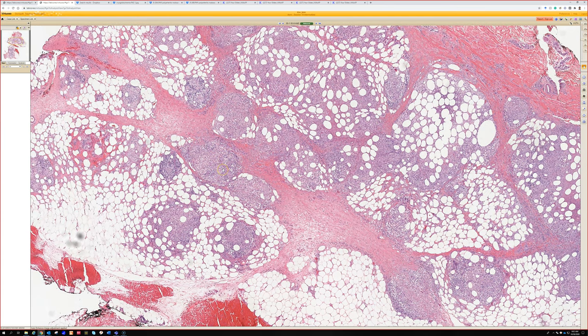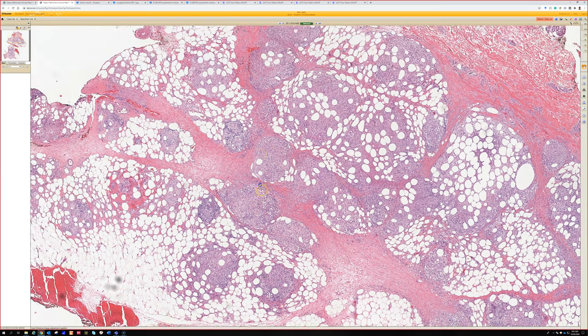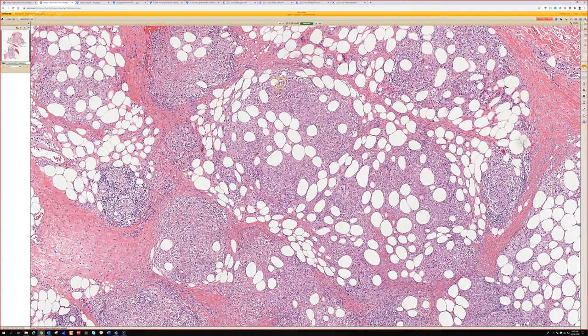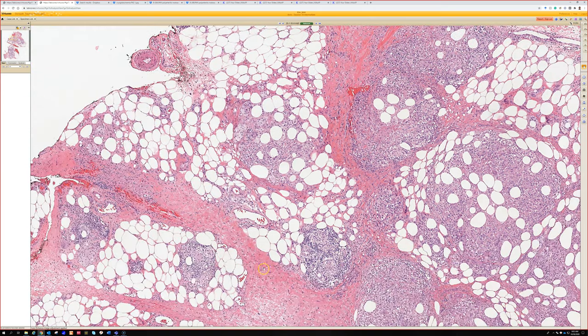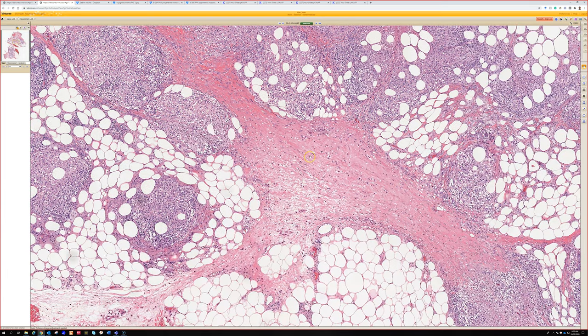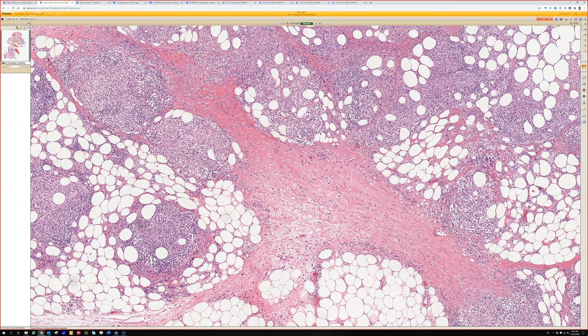If it's really blue, then it would be either neutrophils or lymphocytes — that can be a helpful clue. These are histiocytes and they're arranged into kind of nodules, which we could call granulomas. What do you think it is then? I thought it was nodular vasculitis. Good. This is nodular vasculitis, or if you like, erythema induratum — there's debate over whether those are the same thing or slightly different things, but a lot of people tend to lump them together.